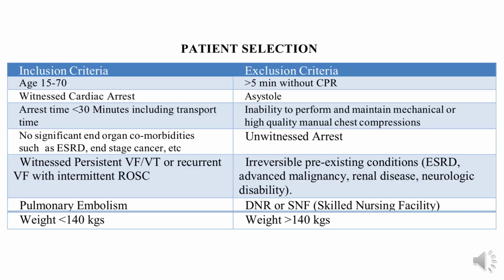And I would certainly recommend, depending on the protocol you guys have, if you're using the ODEMSA, this probably needs to be printed, laminated, and a hang tag on your monitor, okay? Somewhere immediately accessible so you can kind of run this list.